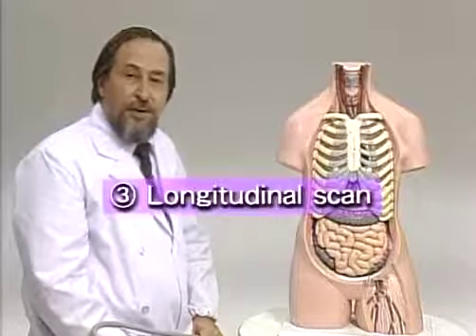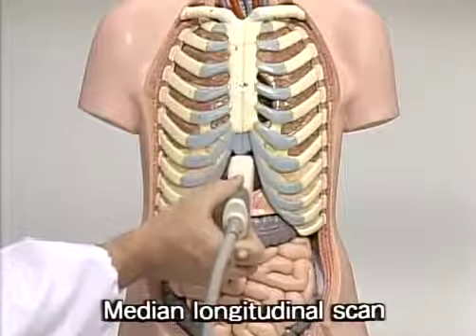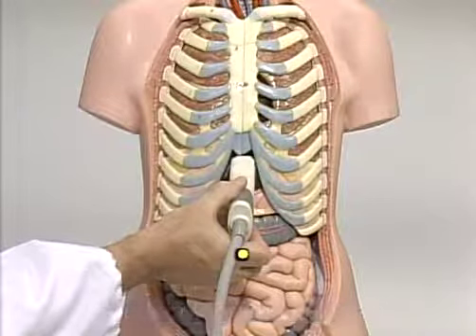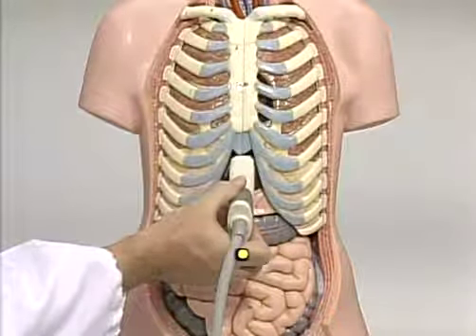The third procedure is the longitudinal scan. First of all, align the long axis of the probe with the sagittal plane of the patient. Then, place the probe on the center of the epigastrium.